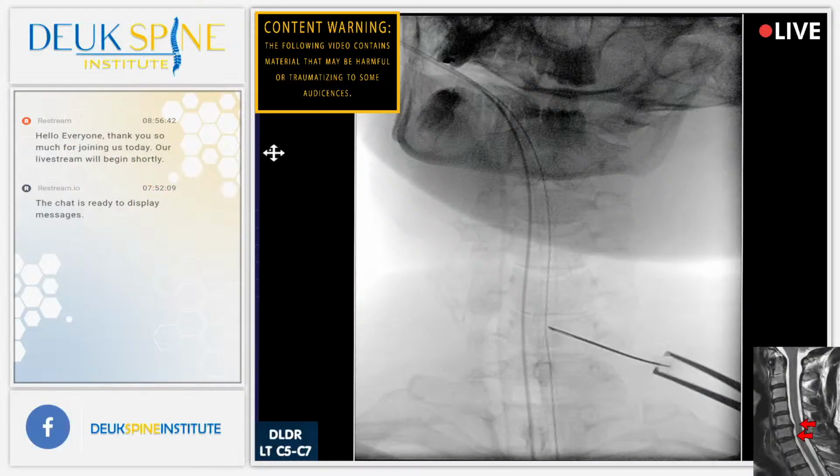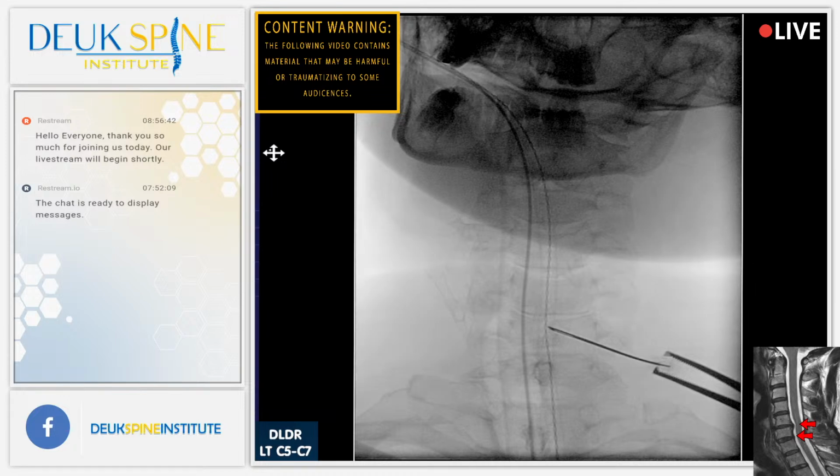Good morning, I'm Dr. Deuk here at the Deuk Spine Institute, and we're broadcasting spine surgery performed live for you. So you can ask questions and you can ride along with us during this patient's cervical spine surgery.